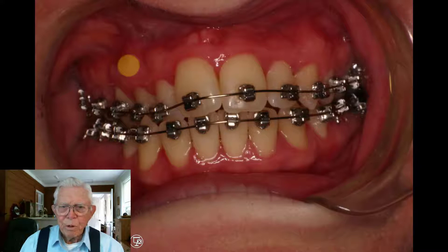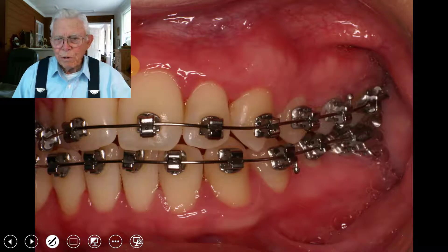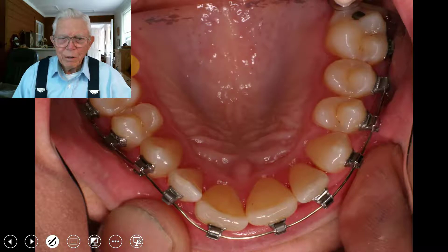We came in with an 018 round stainless steel wire and tried to get it to jump the bite, but it didn't either — the crossbite is still there. It might have been corrected if we had put a bite plate in there to start with; it could have possibly jumped the bite without needing the large arch wire. The 018 arch didn't do much to the crossbite. She chews and bites right into that spot, and it didn't help.